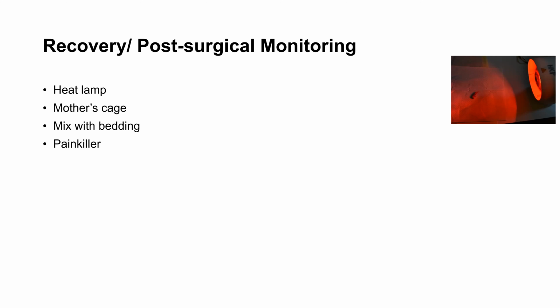And you need to administer the painkiller according to your accepted animal protocol, which might be variable in different regions or countries. And also you need to check the pups 3 days post-surgery. Usually cannibalism happens within the first day after surgery, but you need to control whether they are able to drink milk and the body temperature is okay, or they are accepted by the mother.